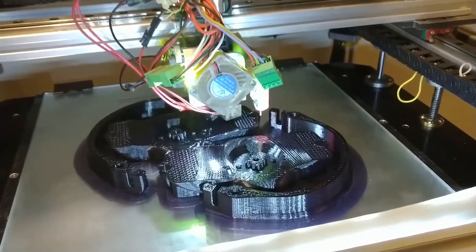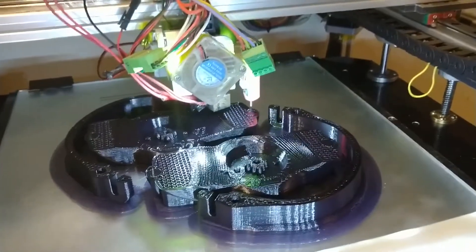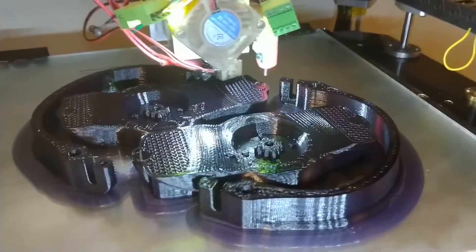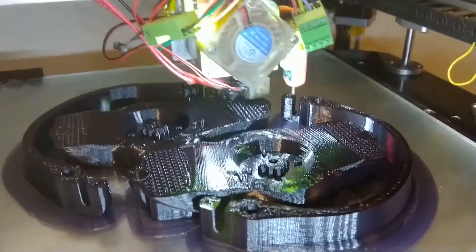The print takes about 17 hours to build, so it's not a quick method of manufacturing. However, it's an ideal way to create and iterate prototypes.